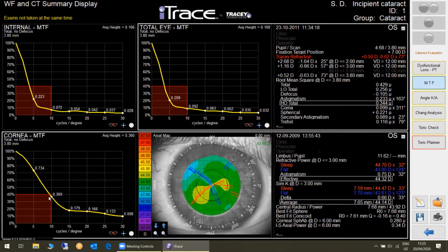So let's say 70, 20, 10, or 60, 20, 20. Whatever you do, you're going to reduce the 100% to lower. It means this yellow line is going to go into the danger zone. And that means that you will have an unhappy patient in your waiting room post-op.